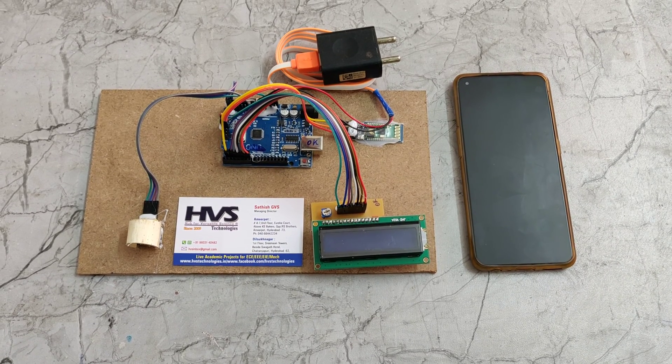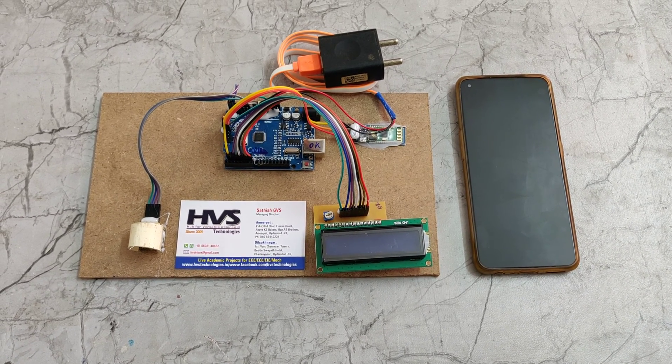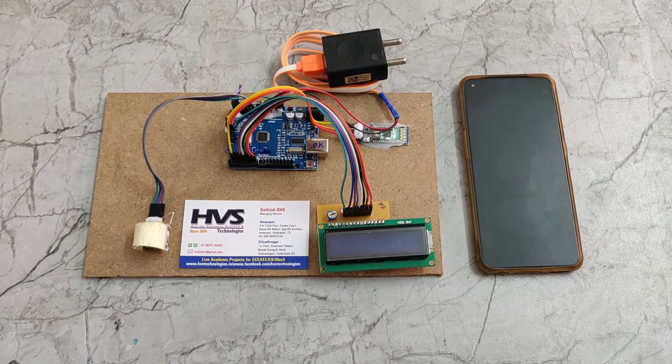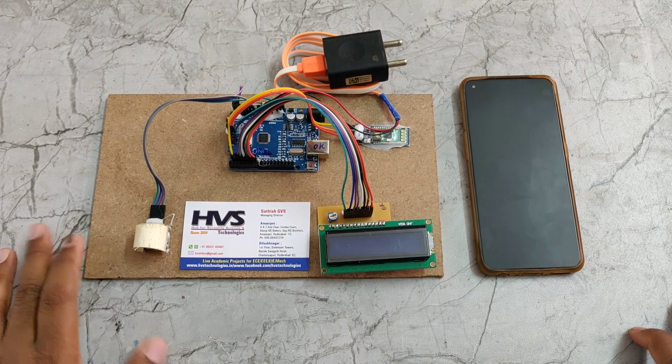Welcome to the project demonstration of Non-Invasive Glucometer using Arduino Uno. We are calculating the glucose levels in blood using this sensor.